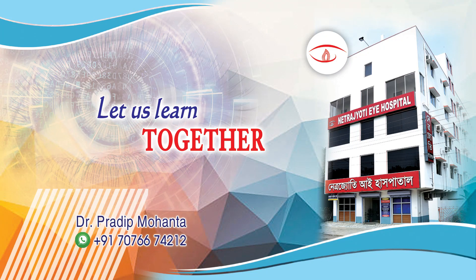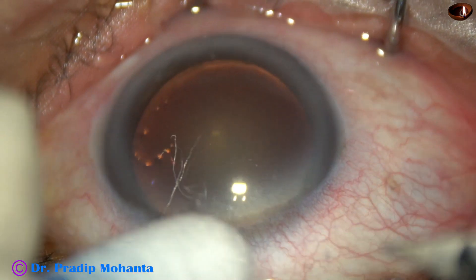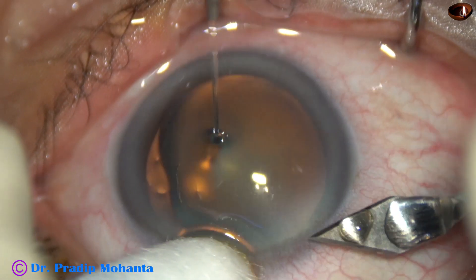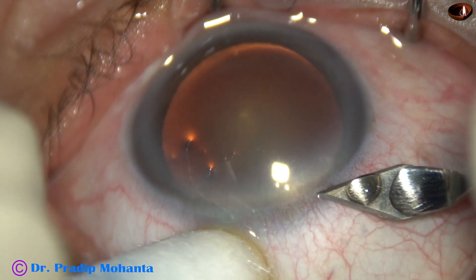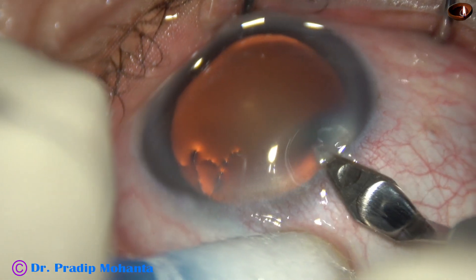Friends, welcome to my workplace at Ranaghat, West Bengal, India. In this video I am going to show the use of a pre-chopper for division of the nucleus into several fragments. Let us observe the complete surgery.